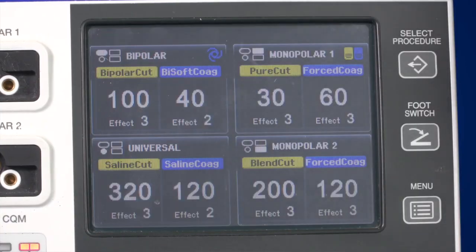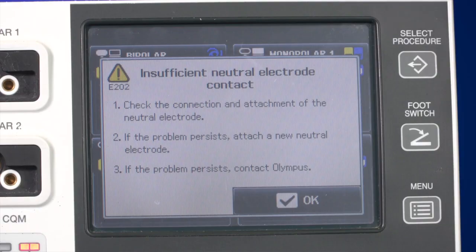There are certain situations in which the ESG400 displays an error message. In this instance, the screen will display what to do for 10 seconds. Alternatively, press OK or activate the instrument to clear the message. Cleaning can be achieved with a soft, lint-free cloth moistened with 70% alcohol. Please remember to turn the generator off prior to cleaning and always dry when complete. If contaminated, a neutral detergent and surface disinfectant can be used.